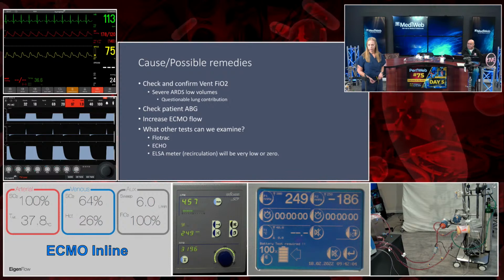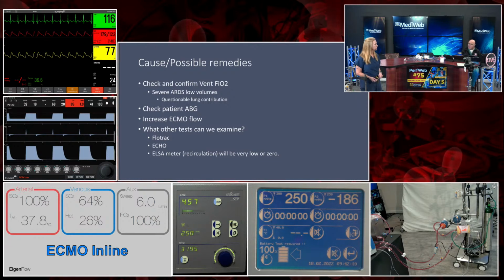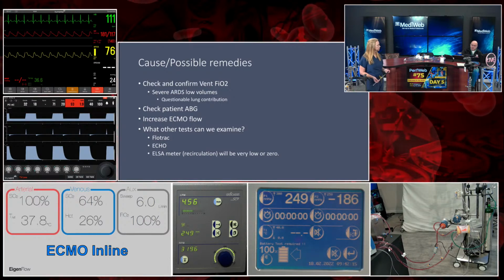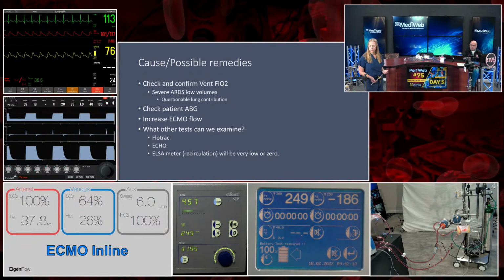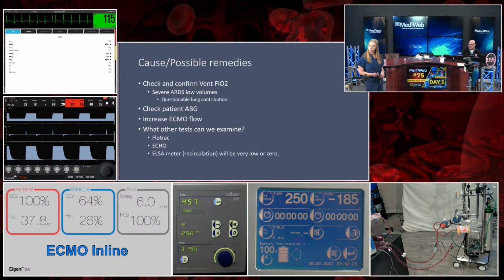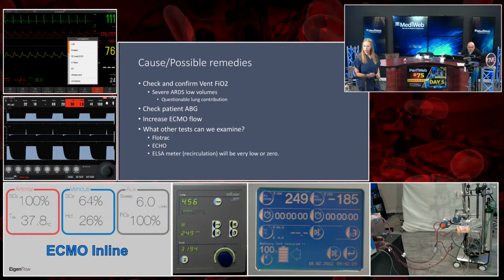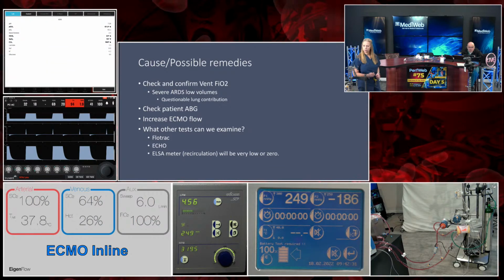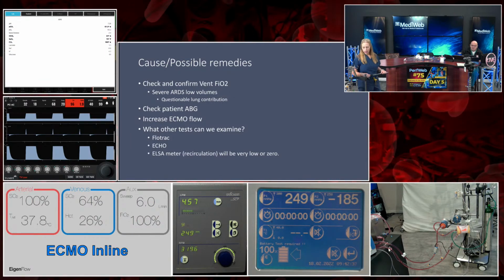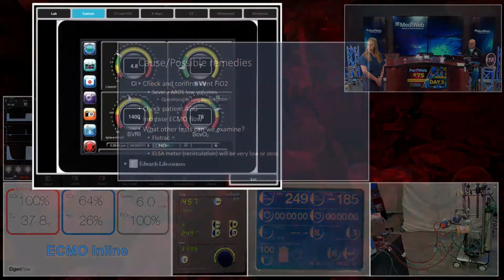Well, we can look at a FloTrac. If you're not familiar with FloTrac, I think everybody is, but it's a continuous cardiac output monitor. So I'm going to pull that up. And we're going to look and see what this patient's FloTrac is. So go full screen, please. I'm having a problem here, so just give me a second. Oh, there you go. You got it? Okay, got it. Great. So go full screen.